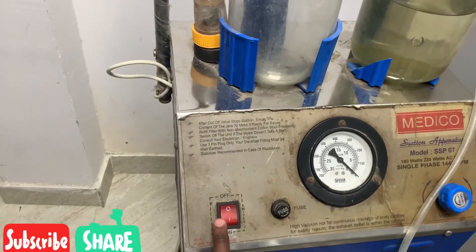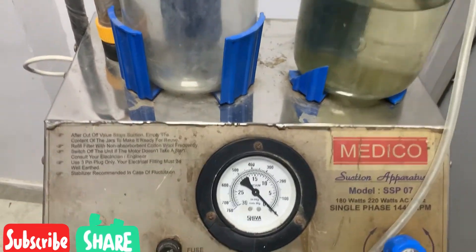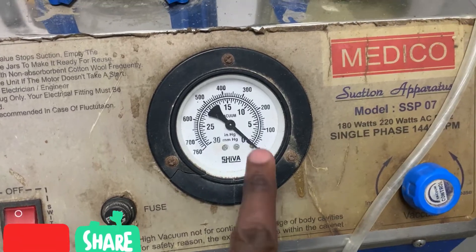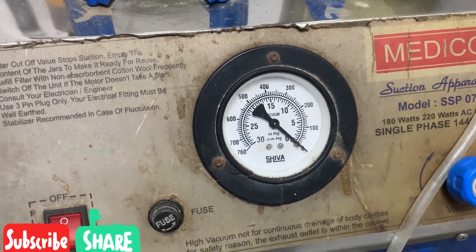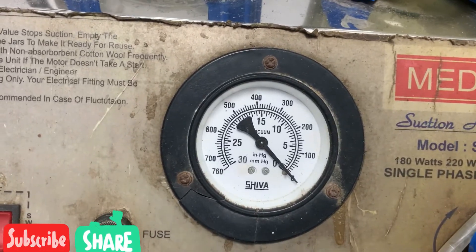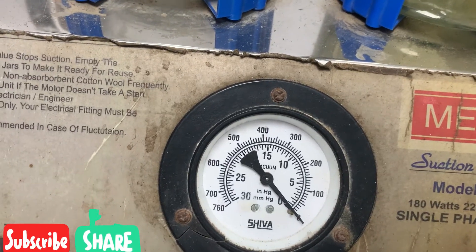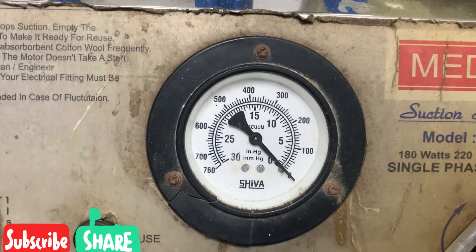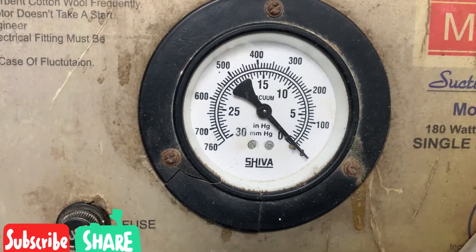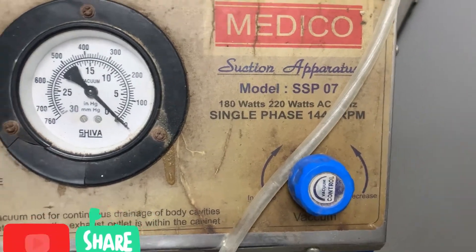As you can see here, this is the switch of the device, and then this is the fuse. This is the vacuum meter that shows the amount of vacuum you want to provide. For example, if this device is used for children, you set it maximum 80 to 100. For adults you put 100 to 200, and in case of OT you can set it up to 300.